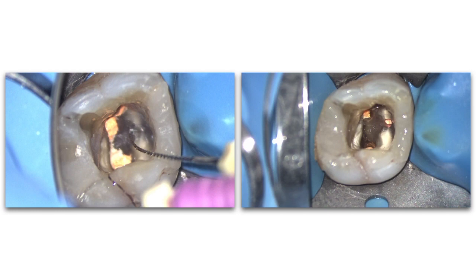If we go back to the previous slide, we know that human eyes are able to see 200 microns. So it is normal not to see the MB2, and this is why most dentists who are not using the dental operating microscope are not able to see the MB2.